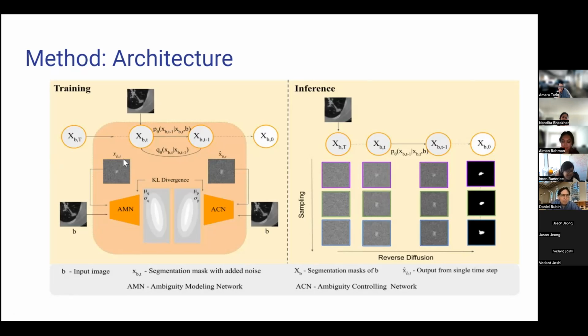Sorry, I'm a little bit confused here. Are you feeding the full image, or a patch of the image? Are you feeding the full CT, or only a single patch from the CT? Yes, a single patch from the CT. How did you identify the patch? It's already processed, it's from the LIDC-IDRI dataset. But don't you think that identifying the proper patch for segmentation, like identifying the location of the tumor, is the primary difficulty? Because once you identify the location of the tumor, there can be a lot of different techniques for segmentation, right?